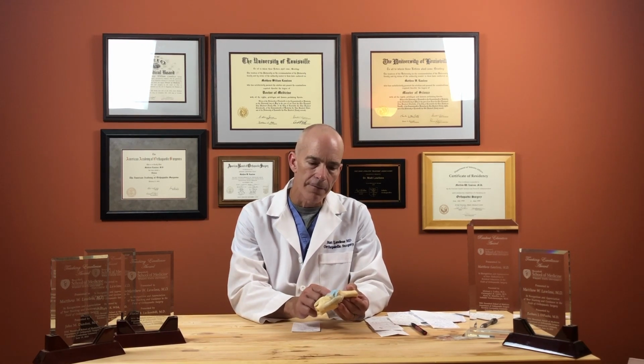When you're going to use a robotic-assisted total knee, first of all, you get either a CT, MRI, or x-rays, and you plug that into whatever system. There are different robotic systems out there. You plug that information into the system and the surgeon decides what kind of cuts: how much he's going to cut off this side of the femur, how much off this side, how much he's going to cut here, how much rotation. Those are things that have traditionally been done the conventional way. There have been lots of studies, and they developed a system where the averages and landmarks let you know where it is. But with a robot, you specifically dial those numbers in, and that's what helps make your cut.